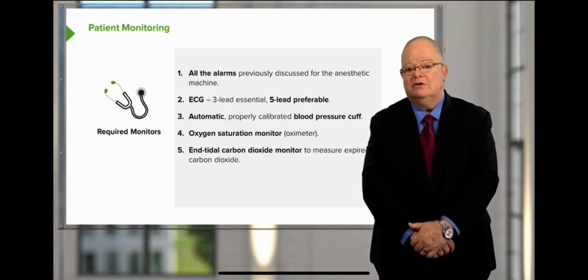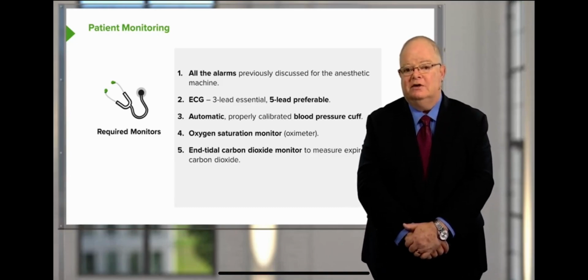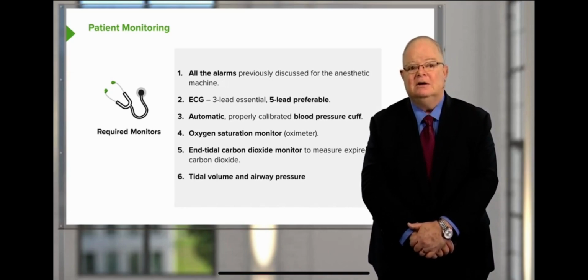And it also allows us to adjust ventilation to make sure the carbon dioxide level is within what we consider to be a safe and normal range. We constantly monitor tidal volume and airway pressure through the machine as well. It's all done in every anesthetic machine virtually seamlessly.